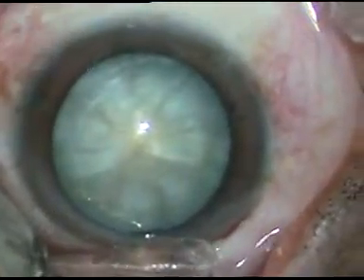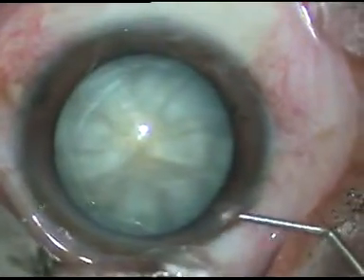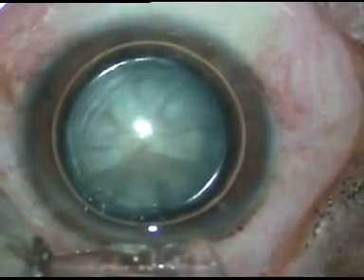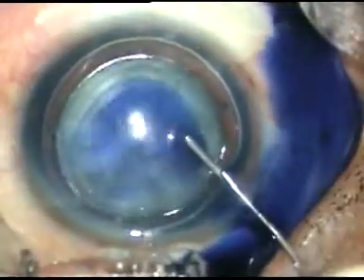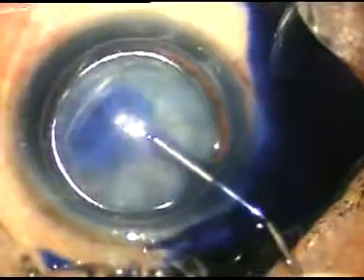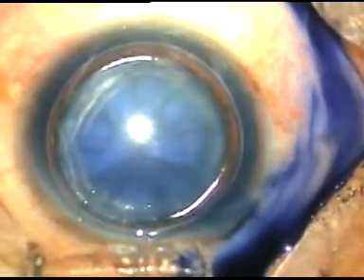Now, I inject an air bubble, and underneath this air bubble I inject trypan blue dye. The dye is not diluted by aqueous. If we inject it underneath an air bubble, staining occurs very fast — within 5–6 seconds you get very good staining.